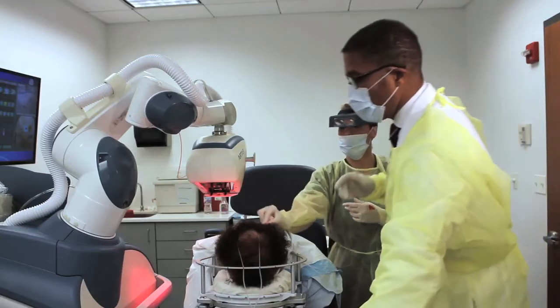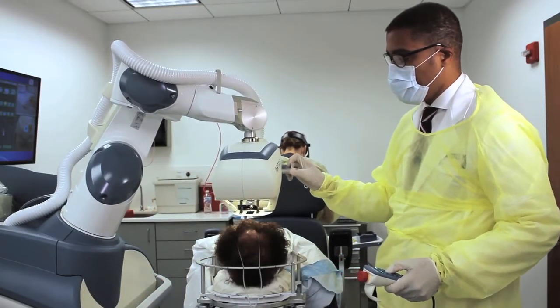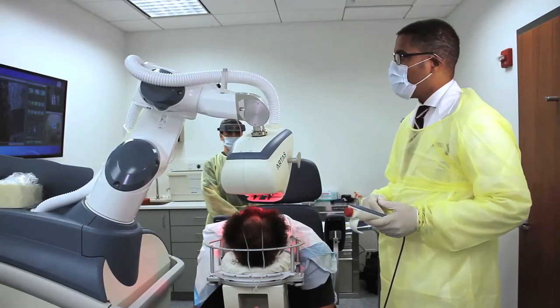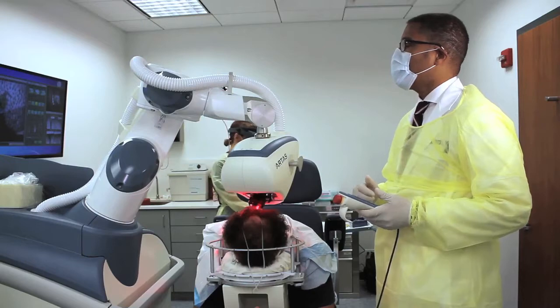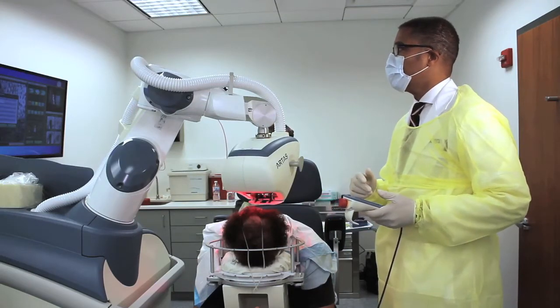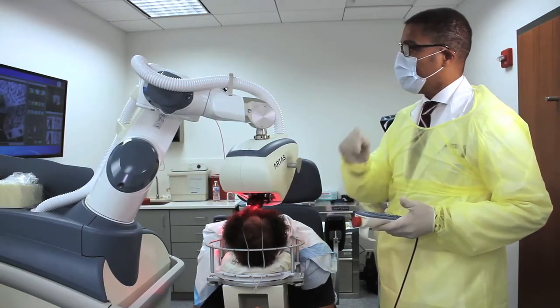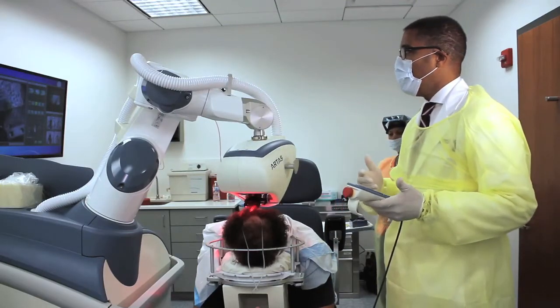So we're going for grid two — same thing again. Bring the robot in, the robot takes a picture of the area, scanning the head. It's doing the same thing: scanning, looking at graft quality, follicular unit, girth. Blanca, I think we can decrease the spacing a little bit — I would go down to 1.8 on this one. We're going to make them a little closer because the density is a little better in this grid. That takes some skill, knowing how close you can get depending on the hair texture. So when it's all said and done, you can't see a Swiss cheese effect back there. Every graft, I'm looking at: too shallow, too deep, too flat, too steep.